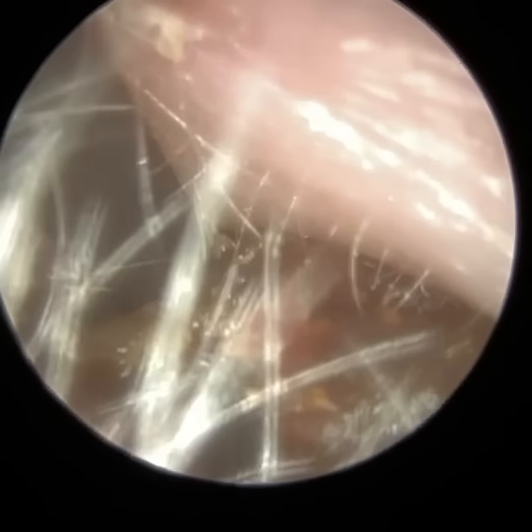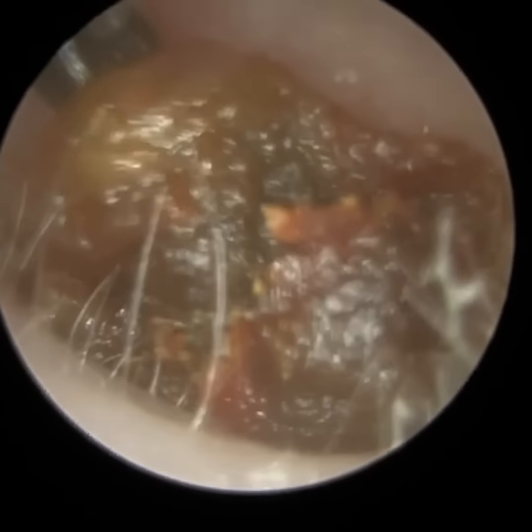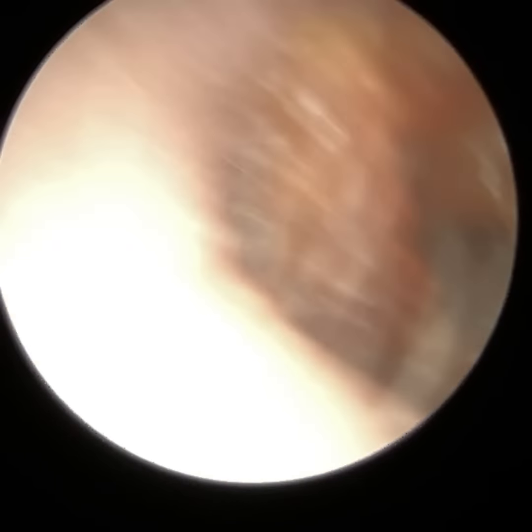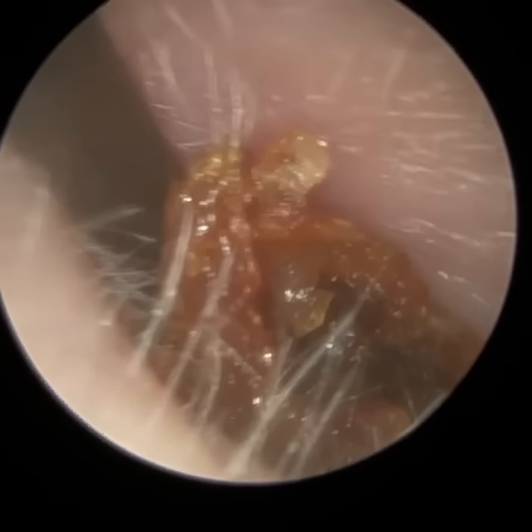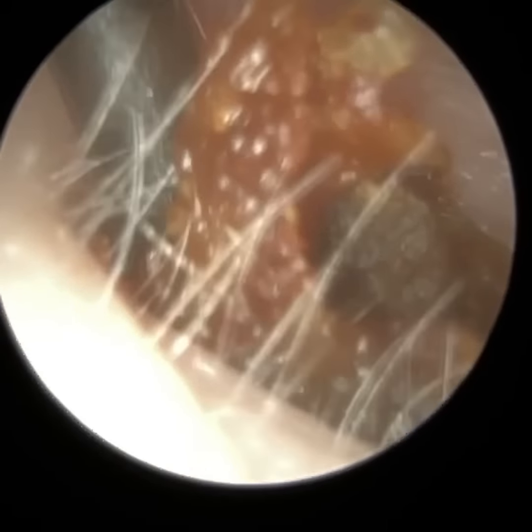In fact, they're more oval-shaped, and they have a sigmoid shape — an S-bend. The bend is more pronounced in the outer third of the ear canal. Just to the left, that's the first bend, about half a centimetre into the ear canal. And then a further half a centimetre to the right-hand side, you'll see the second bend, where the ear canal meanders back to the right.